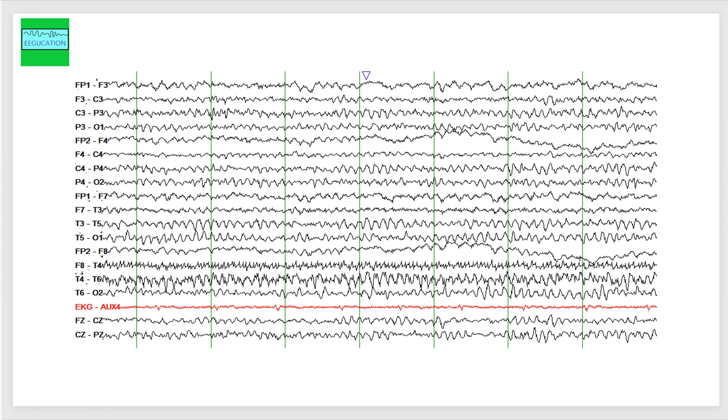This is what we call a breach rhythm. B-R-E-A-C-H, breach rhythm. Breach rhythm basically shows higher amplitudes and faster frequencies. If a person has had resection or some other area of encephalomalacia in the same area, you can also get slowing in the same distribution, but that slowing is not called a breach rhythm.